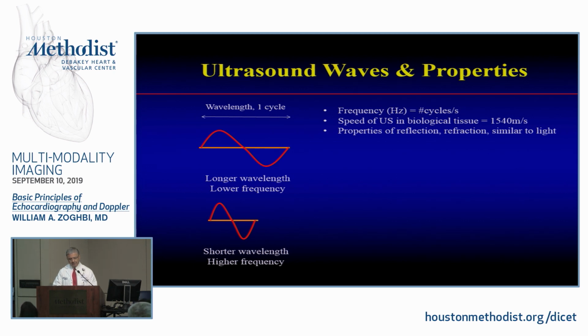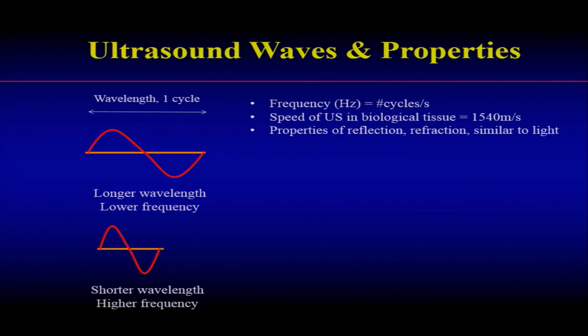One is, yes, we send packets of waves, and they're in the ultrasound range, meaning you can't hear them. They're in the megahertz, and the audible range is usually in kilohertz, right? Up to maybe 20, and if you're young, you can maybe hear that, but for us, getting a little bit advanced in wisdom, we may not hear those very high frequency sounds.